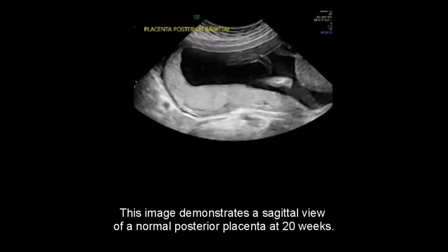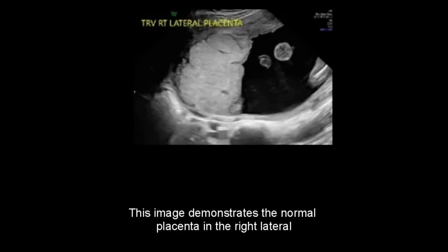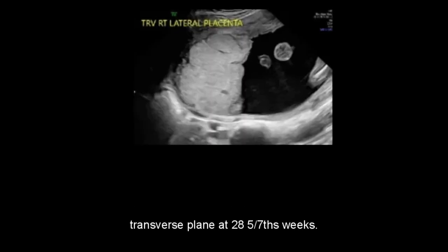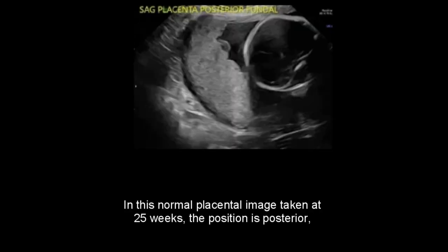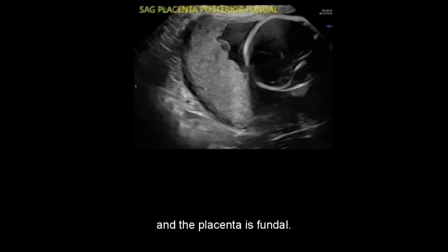This image demonstrates a sagittal view of a normal posterior placenta at 20 weeks. This image demonstrates the normal placenta in the right lateral transverse plane at 20 weeks and 5 to 7 days. In this normal placental image taken at 25 weeks, the position is posterior and the placenta is fundal.